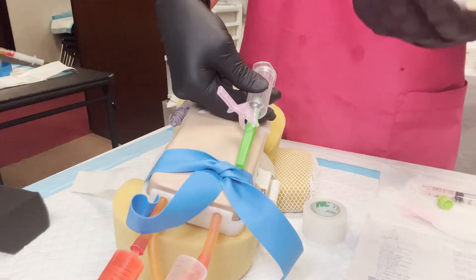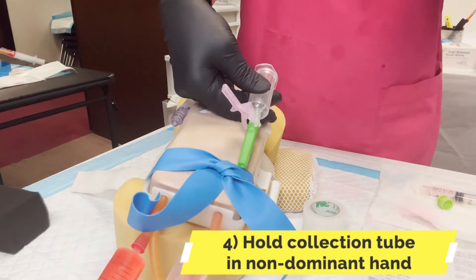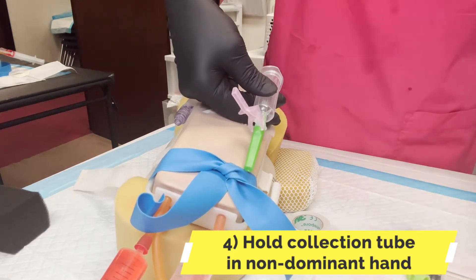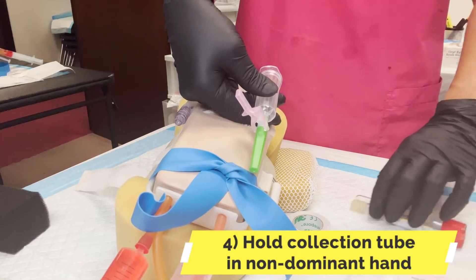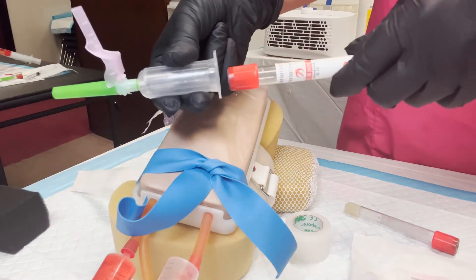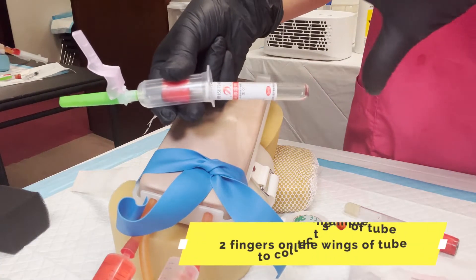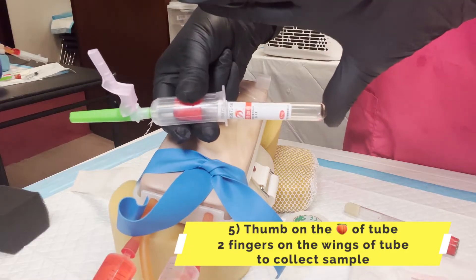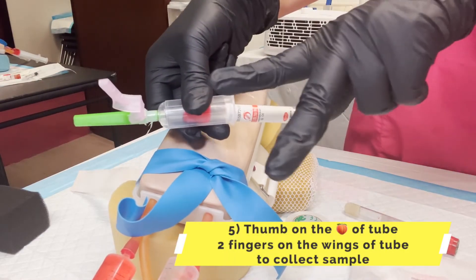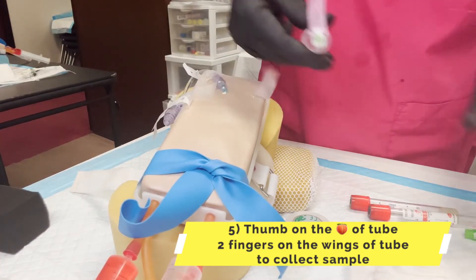Where does your tube go? Your tube is on the hand that's not working. Do not put it in your sterile field. There should be no package in your sterile field. This is how you hold it, and this is how you put in the tube. When you're in the skin, it's important to put it in — put your thumb at the butt of the tube, then two fingers, use the wings.